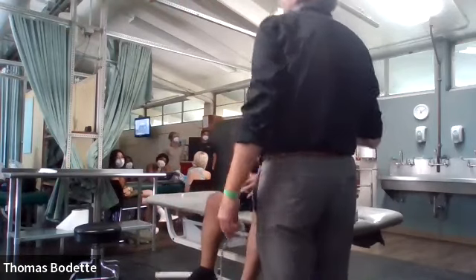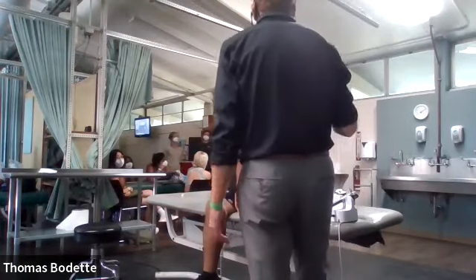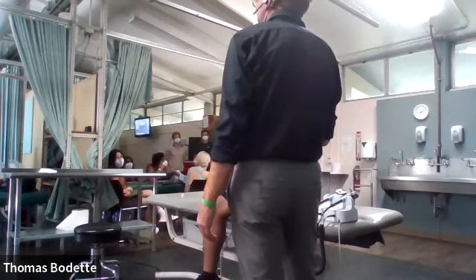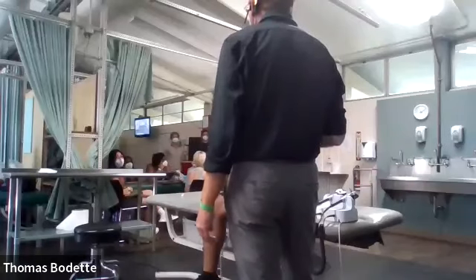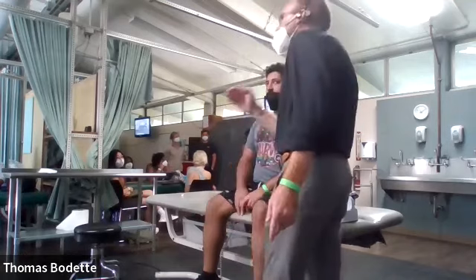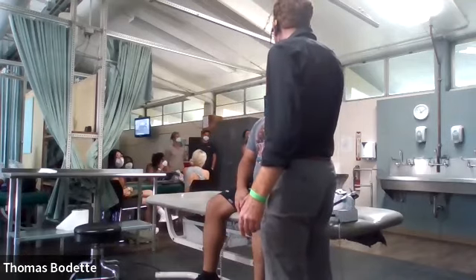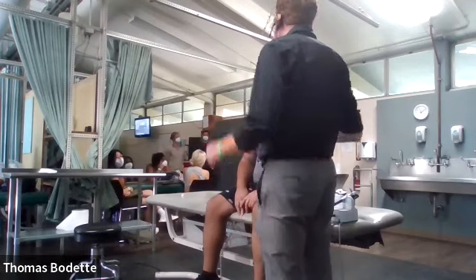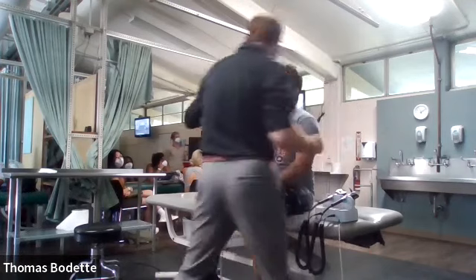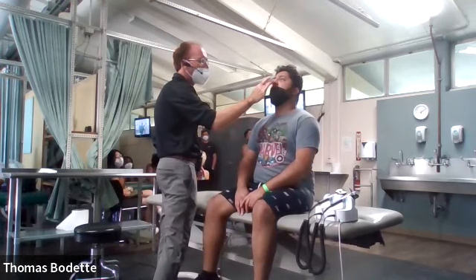All right, so a couple of things we're going to be looking for on your performance of rhinoscopy. Number one, want to have the patient seated. If you're not very tall and your patient is, then put them on a stool to make it easy for yourself, but they probably need to be in the seated position. Patient position is going to be important. We're going to have the patient's head back in extension slightly. And before inserting the otoscope, you're going to take one finger and press the tip of the nose in like so. So what's the purpose of doing this?